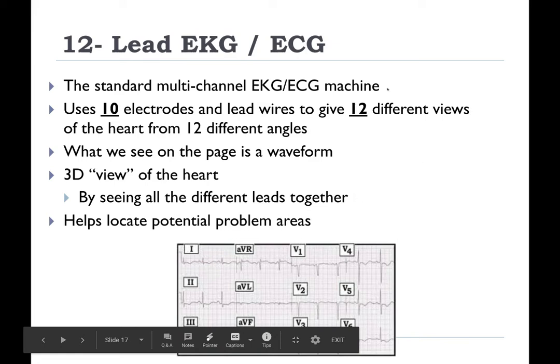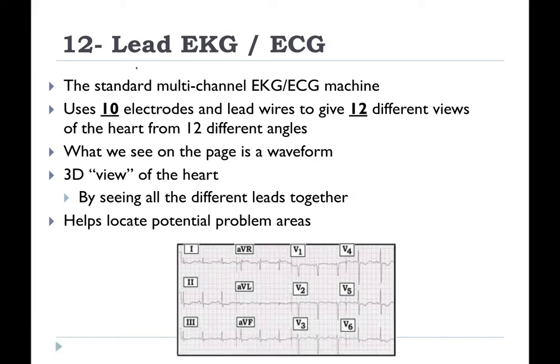So I worked with a cardiologist once who would just say, can you get a 12 lead on the patient? So he wouldn't even say the word EKG or the acronym EKG. He just wanted 12 different views of the patient's heart. So you might hear it referred to that.